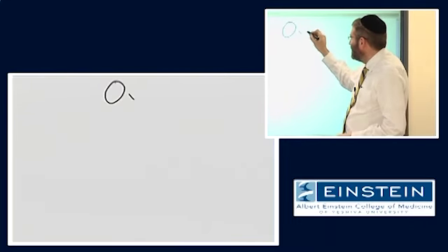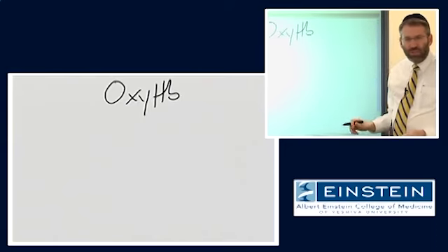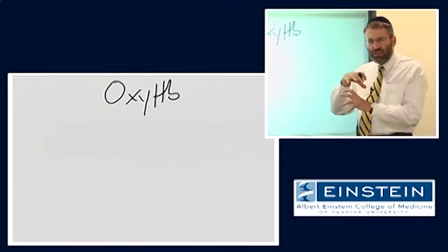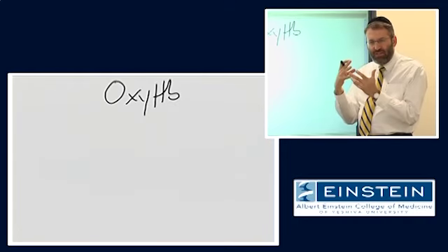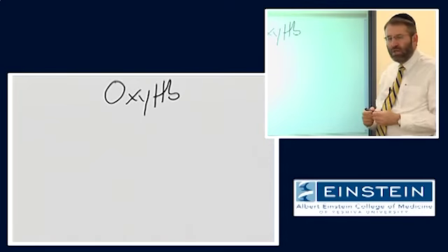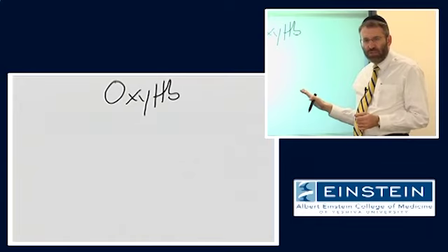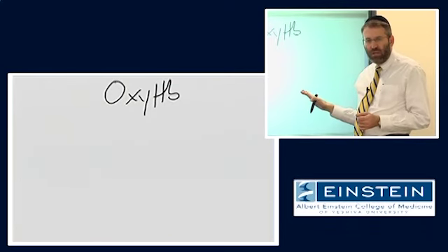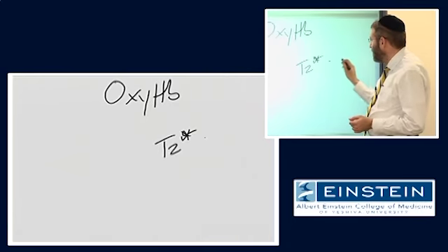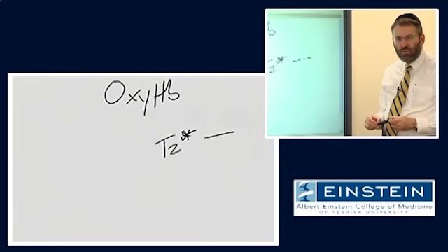Oxygenated hemoglobin, right? So the oxyhemoglobin molecule, because of the oxygen atoms, they shield the paramagnetic nature of the iron in the core of the hemoglobin molecule. So there is no magnetic susceptibility gradient. And if you look at a T2 star image, there is 0 signal loss in the setting of oxygenated hemoglobin.